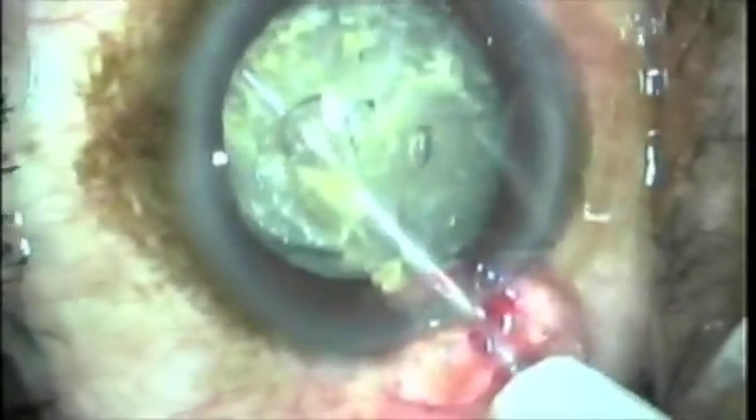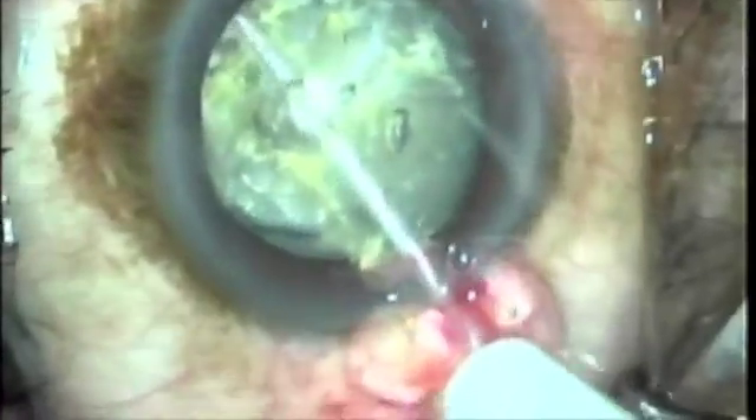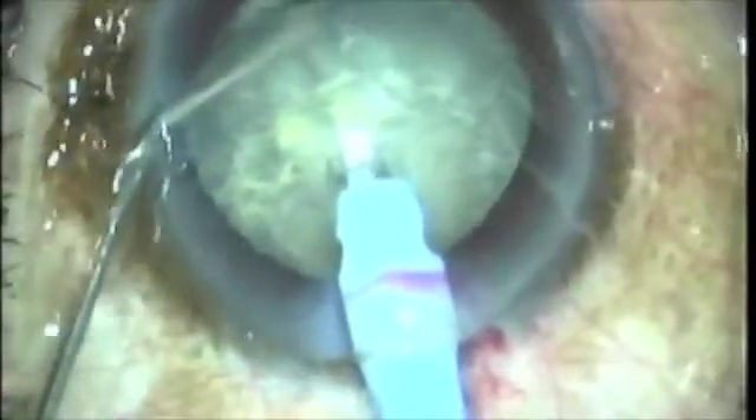Here you see a white cataract. We do a capsulotomy — you merely trace over the anterior capsule. I'm enlarging it. Now I'm going up under the iris so that I can impale this nucleus, pull it out of the lens bag with the Phacotep, and pull it into the iris plane so that I can manage it and crack it in a very easy fashion.